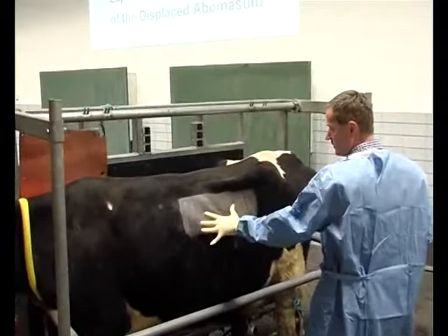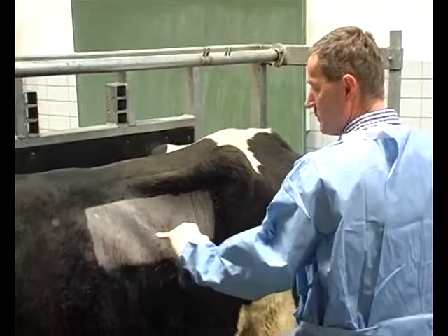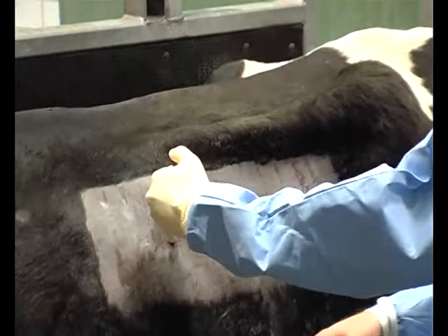This is the rumen. It goes up and down, and I will make a local anesthetic here. This is the last intercostal area. Don't make the incision too high because your applicator has to come to the other side. So we make an incision here, and some vets make a second incision at this position to make it easier to bring your applicator to the other side. But in our practice, we only make one incision at this area.